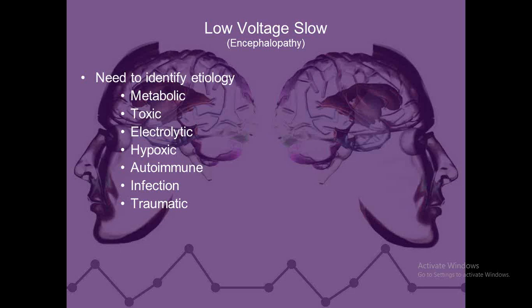That's again why we want to get back to the basics of this, is we want to identify what's causing the symptoms and try to treat it. We stand in a great position as neurofeedback people that do EEGs and qEEGs. So that would be considered hypoxic encephalopathy.